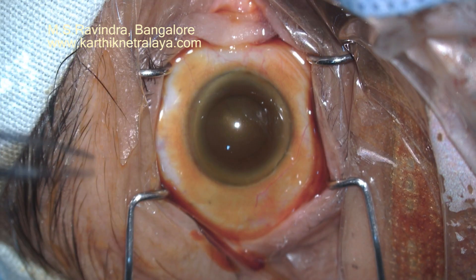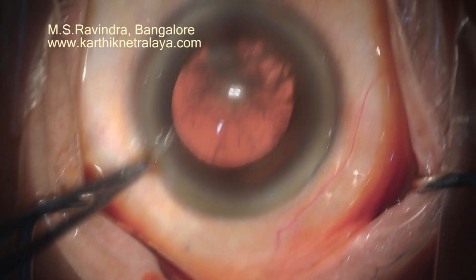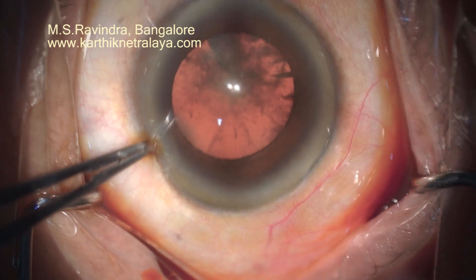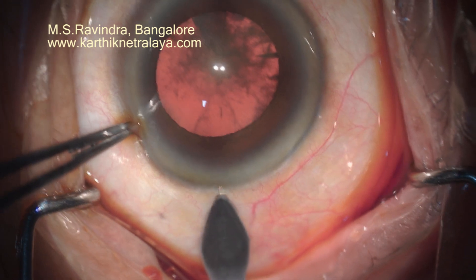It is a very low-flow technique and a low-pressure technique. The pressure inside the eye remains low throughout the procedure — it is not high — and it is especially friendly to the zonules and the capsule.